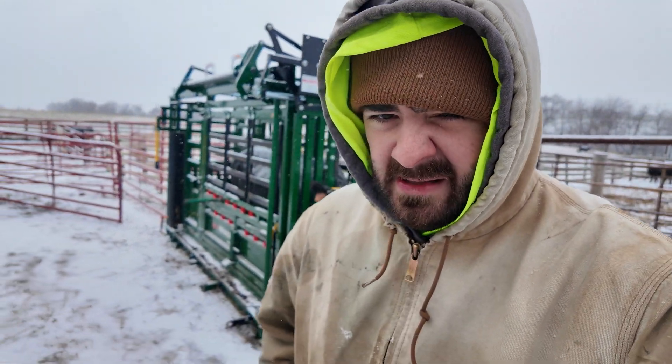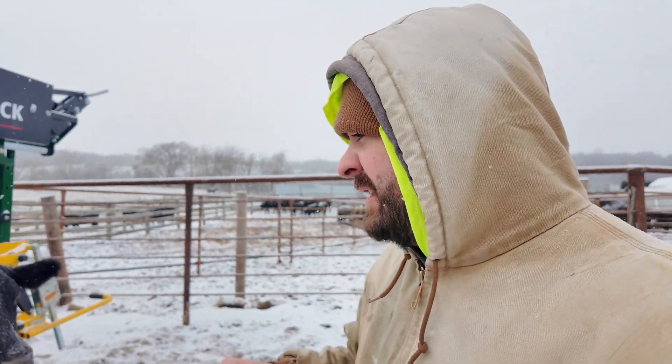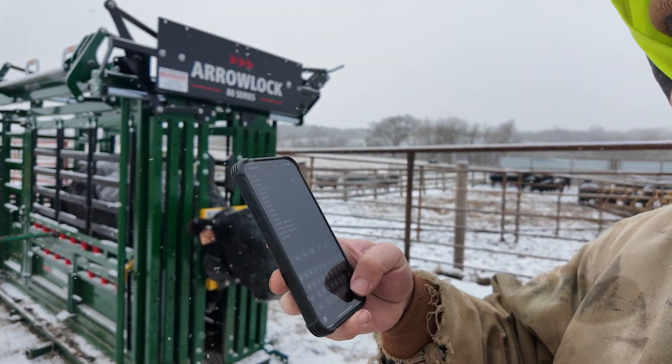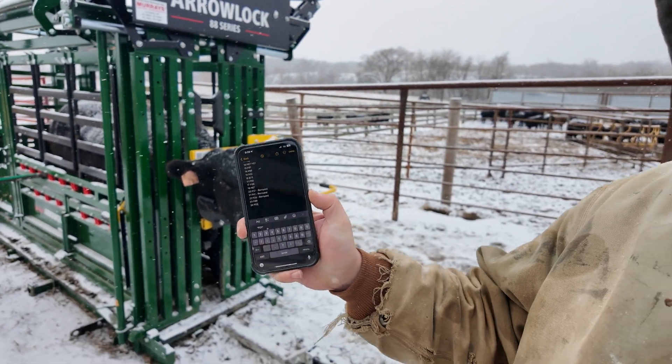When you send these samples in, this is the BioPryn blood test. What you need to do is start a numerical order of the number of cows you've run through. She is number 24 and she's going to be the 23rd run through, so she's sample number 23. I'm going to write that down in my app — cow 24 is P23. That's all you need to do so that when you submit the blood samples on paper, they have a sheet where you fill out what number's what. It's a redundancy for the lab so samples don't get switched up.